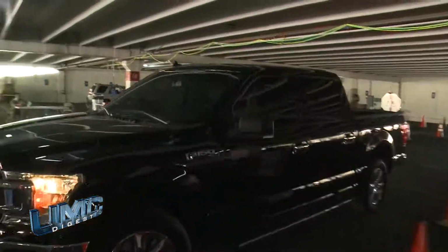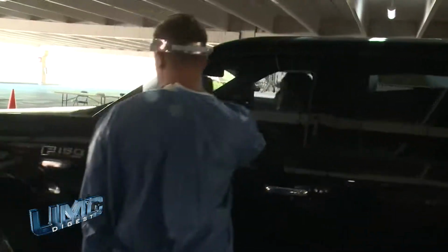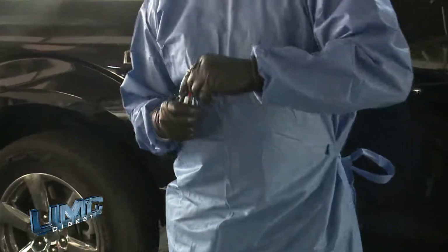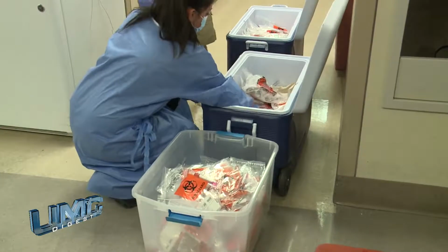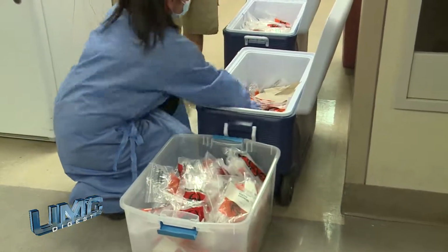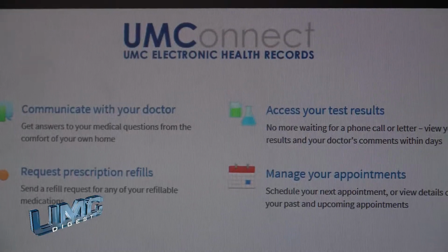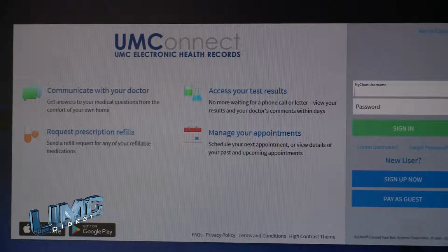If you are registered for a COVID-19 PCR test at one of our drive-through testing locations, you're already registered in our computer system for the hospital. And whenever your specimen arrives in the laboratory, it already has a barcode and a label on it. So we can bring those into the laboratory very quickly. It's run through the testing process. It's resulted in the computer system that's interfaced with the hospital computer system, and the patient can get real-time results through the UMC Connect portal. And literally, when we result the test in the laboratory, it moves directly to that portal and makes it available for the patients to see.